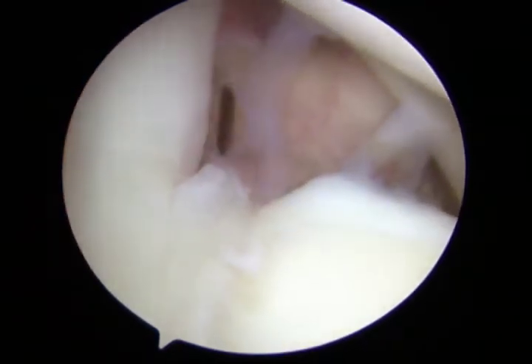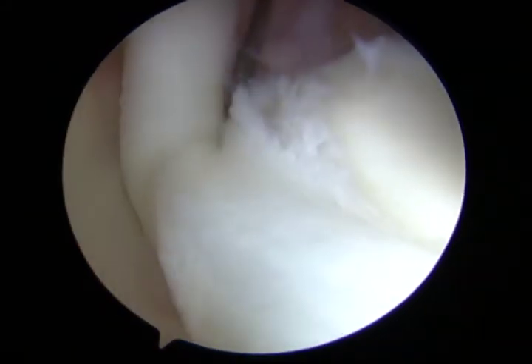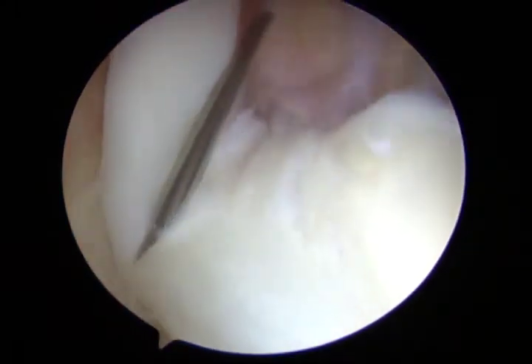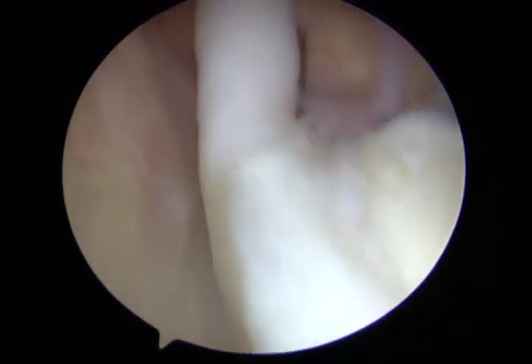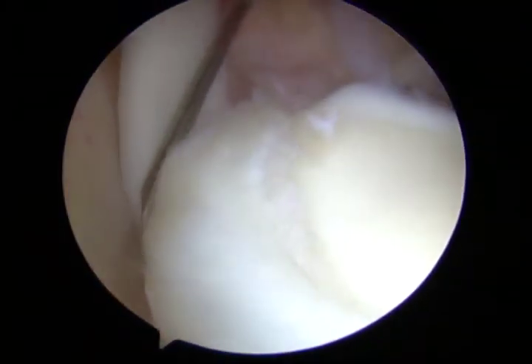It is important not to leave a stump of biceps behind on the superior labrum. Next, the bevel of the needle is placed at the attachment of the biceps, and the sharp edge of the spinal needle is then placed in contact with the inferior aspect of the biceps tendon. Pressure is applied and the blade is withdrawn carefully, and a sawing motion is used to perform the tenotomy.